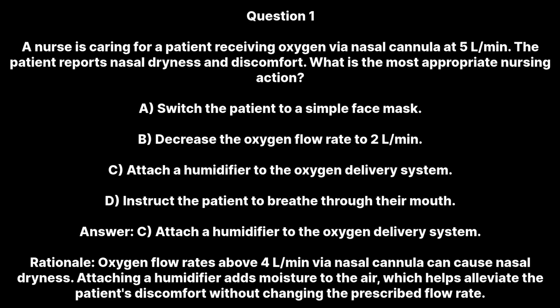A. Switch the patient to a simple face mask. B. Decrease the oxygen flow rate to 2 liters per minute. C. Attach a humidifier to the oxygen delivery system. D. Instruct the patient to breathe through their mouth. Answer C. Attach a humidifier to the oxygen delivery system.